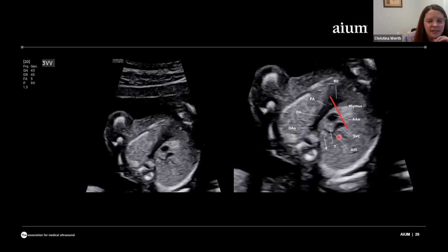And we don't see that all the time, but I do feel like, especially on patients who image well and with some of our machines getting better and better, we are seeing that a little bit more often, but it should never appear dilated or large. So that's important to take a look at as well if you are seeing it.